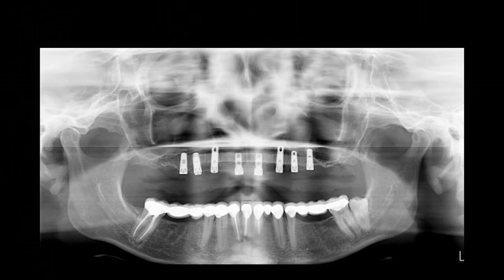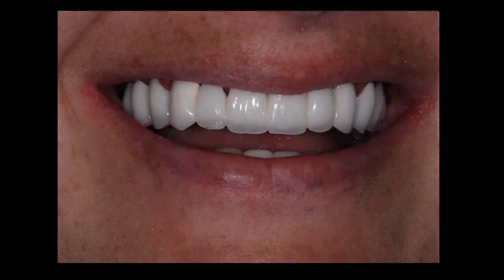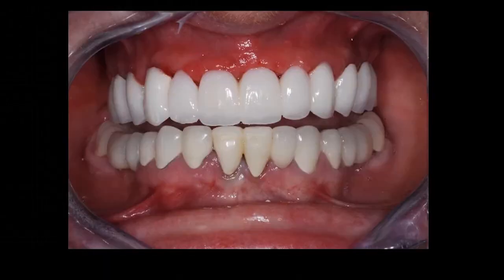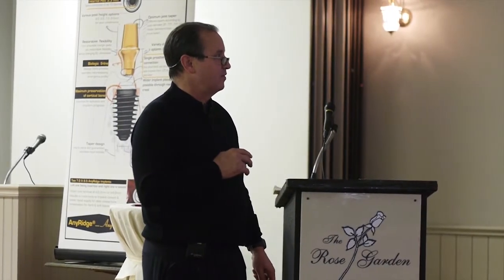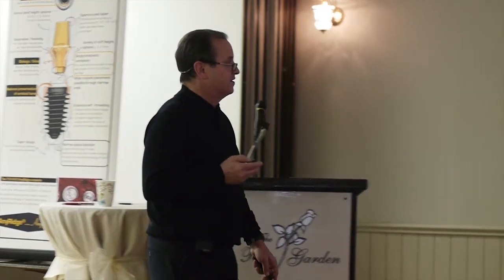We were using a micro-etcher with glycine in it. Now I'm using that, and I'm also using a titanium brush. We're going to use tetracycline application for 3 minutes. Come back and polish these necks up real good, and then come back and add Fusion bone, freeze-dried bone, PRF over that, close it up. We buy a little bit of time. There's a PRF right there. But is that going to cure it? I doubt it. I really do. Because the guy smokes 3 packs a day. He's not going to heal worth a damn. I don't even know why we did this.